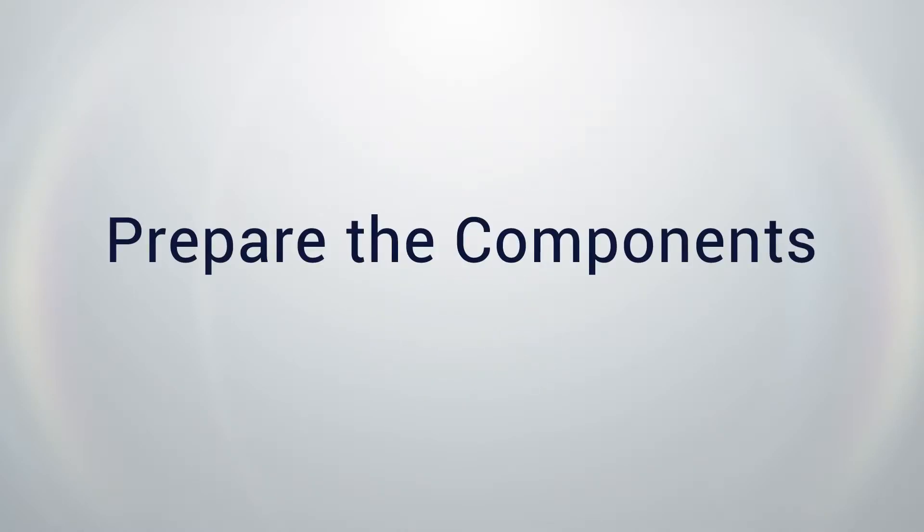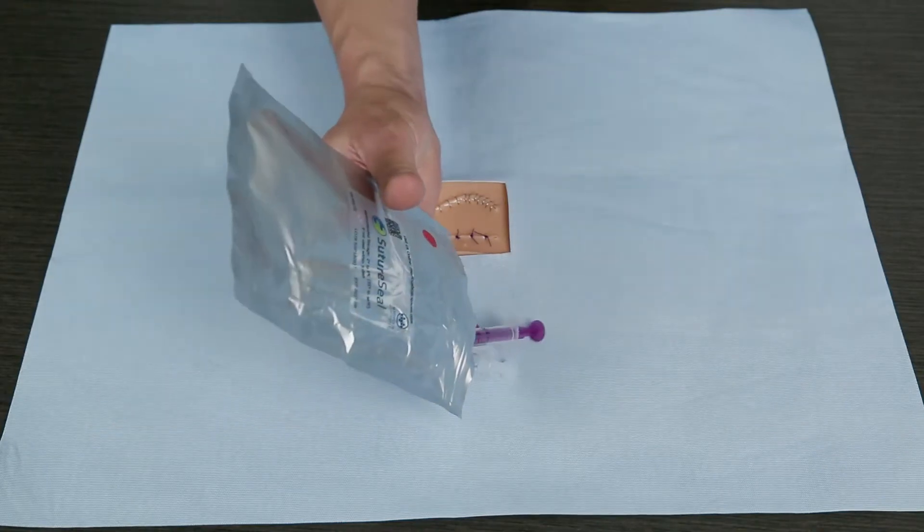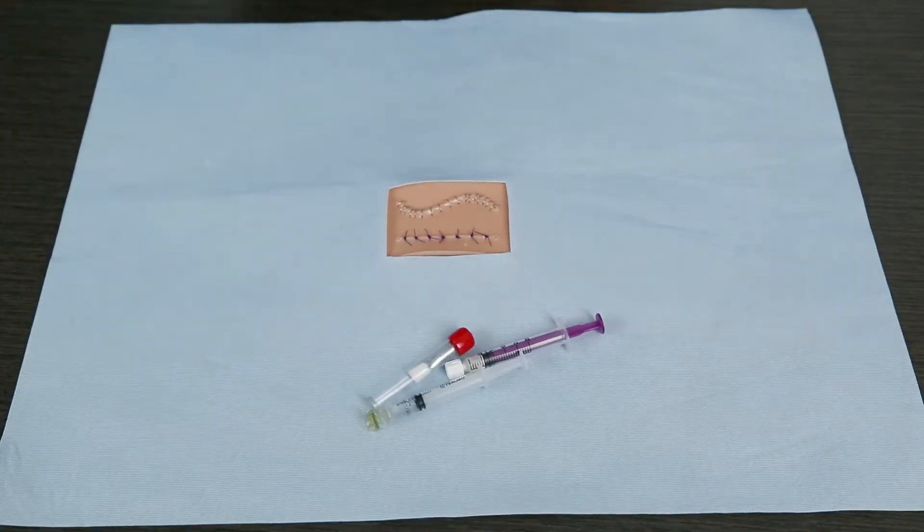One, prepare. Two, mix. Three, apply. The first step is to prepare the components. Open the foil pouch and remove the three components: two syringes and a tube case containing the application brush.